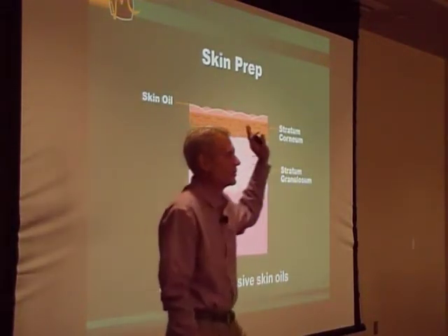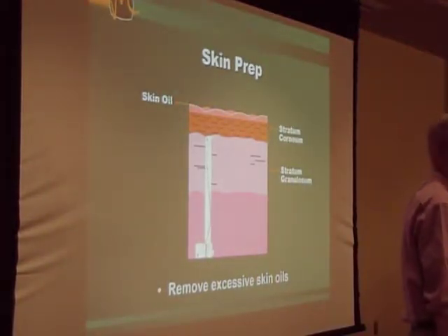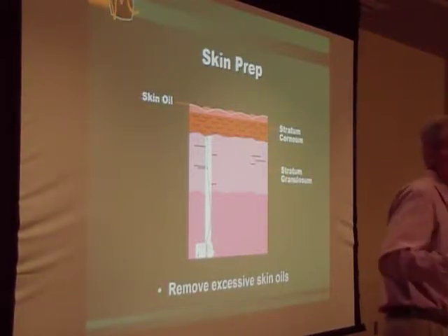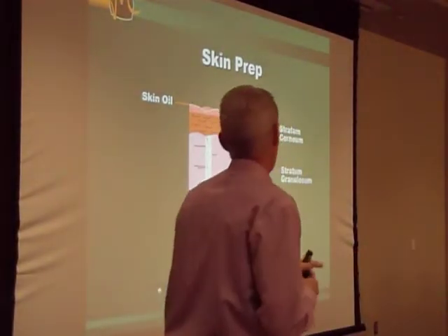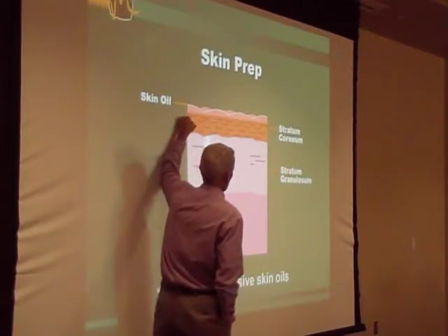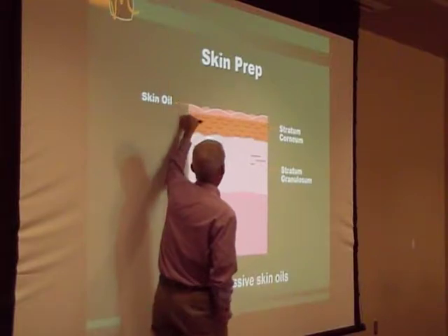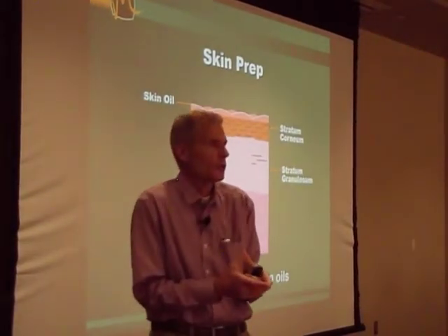Who here has had a stress test done before? How do they prep your skin? Doesn't feel good, does it? No. By the time you're done, your chest is red. I've even seen in old scenarios where they've used sandpaper, where they will actually take your skin oils off, they will scratch the skin surface down. The reason they do that is they want to make sure that the gel will seep in and adhere so we can isolate just the cardiac signal.